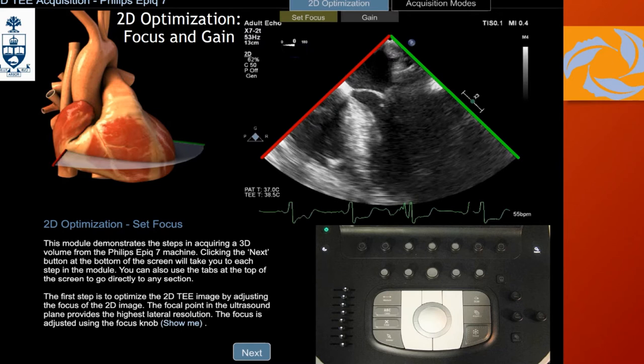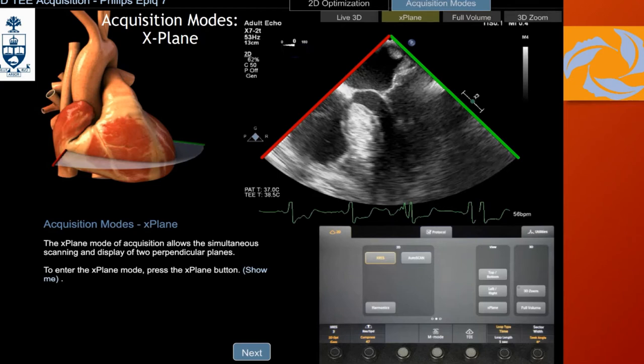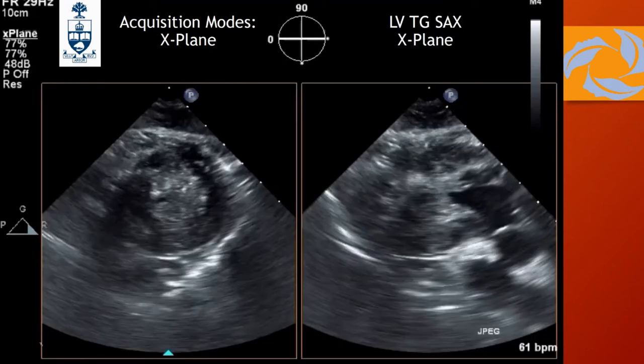We are going to go through all the possibilities when using the Philips machine — X-Plane, 3D full volume, and 3D zoom. Starting with X-Plane: it's going to give you the perspective of the image in our classical view. For example, using it from the four-chamber view, you're going to get a perpendicular plane that is in real time. I know it's 2D images, but you're really using 3D technology here — your matrix array is doing that, cutting the planes and allowing you to see them.